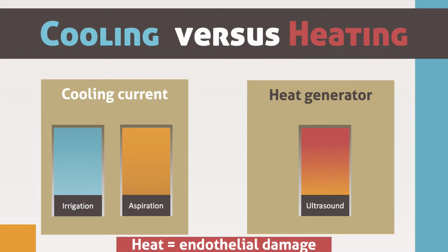During phaco, irrigation and aspiration make a cooling current to lower the temperature inside the eye. However, the ultrasound is the main reason for generating heat. So excessive ultrasound can result in heat generation, which in turn results in endothelial damage and wound burn.